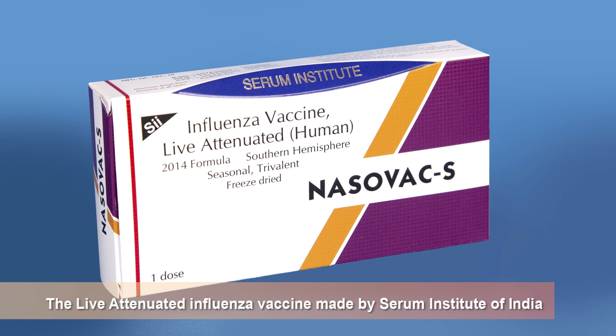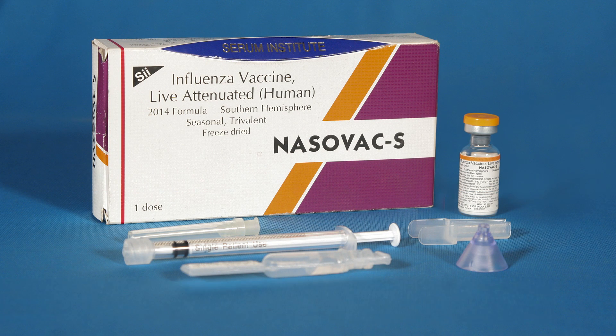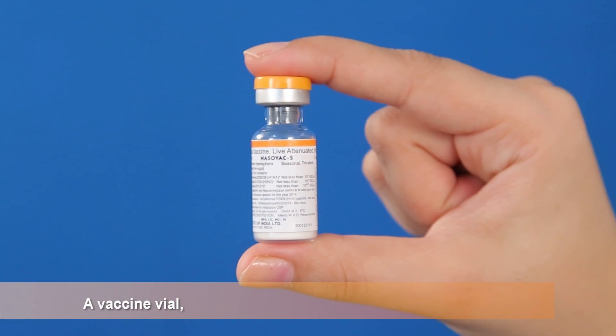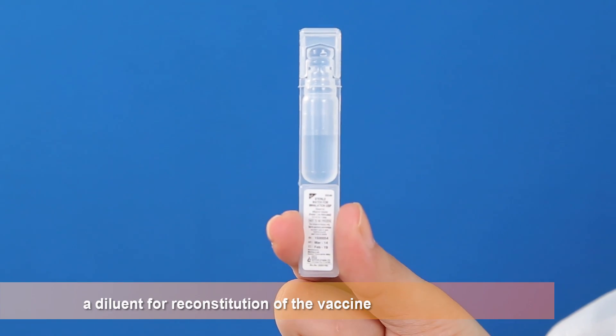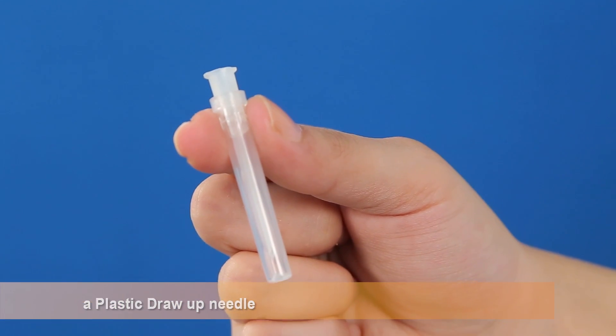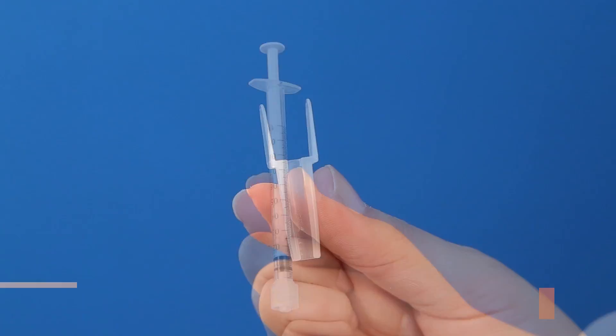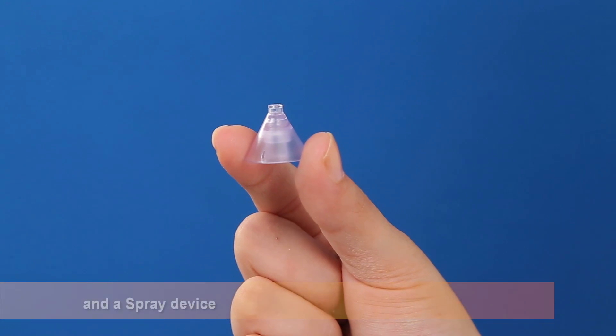The live attenuated influenza vaccine made by Serum Institute of India is an intranasally administered vaccine. This pack contains a vaccine vial, a diluent for reconstitution of the vaccine, a plastic draw-up needle, a 1 milliliter reuse prevention syringe, a dose divider, and a spray device.